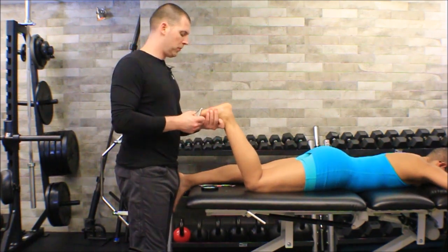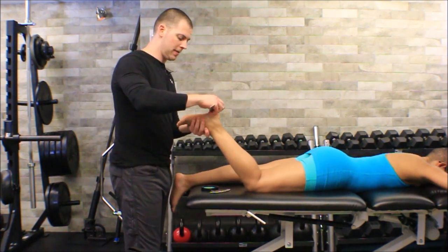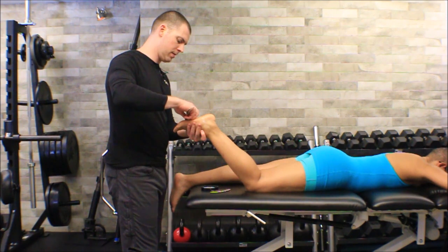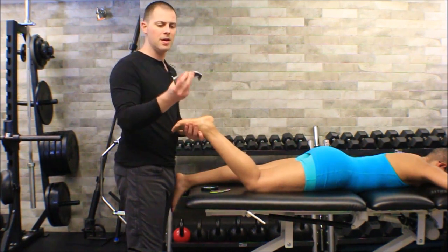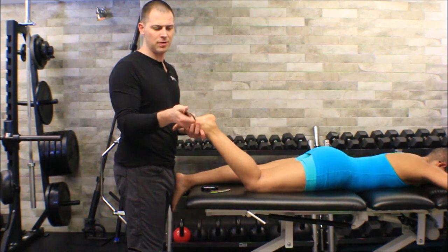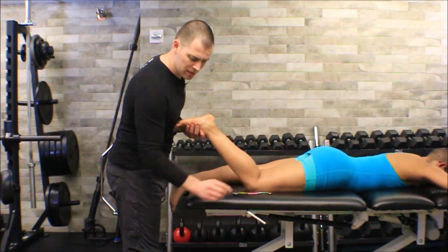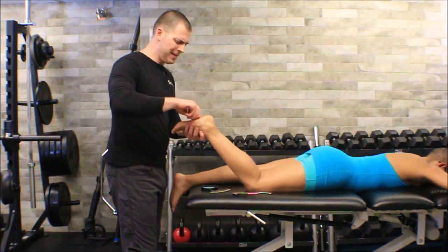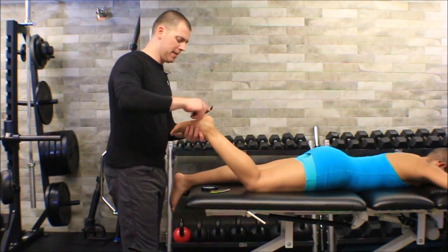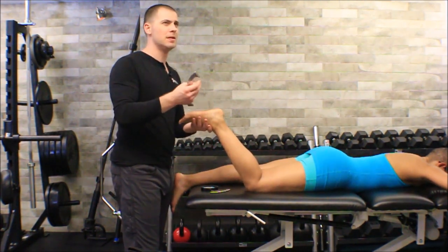All right, so once I have our foot here, the first thing we want to do is we want to scan, right? So just like we did with the crural fascia, we're just going to start at the back of the heel and kind of run one of our tools through the length of the foot, right? And you guys can see here, I'm actually using this batwing tool because it has a double bevel, right, which means it's been shaved down from both sides, which is a little duller than those single bevels. The bottom of the foot's really sensitive. If I were to use this scanning tool, it can be really intense. Maybe I don't want to start that way. All right, so I'm going to scan and notice any difference in tissue tension or tissue feel, right?